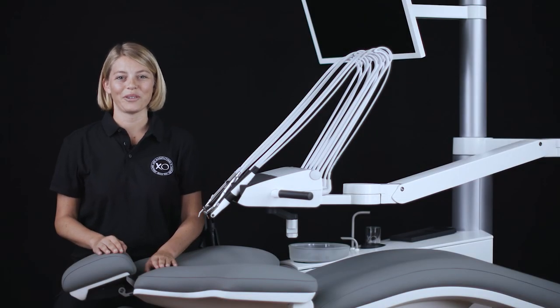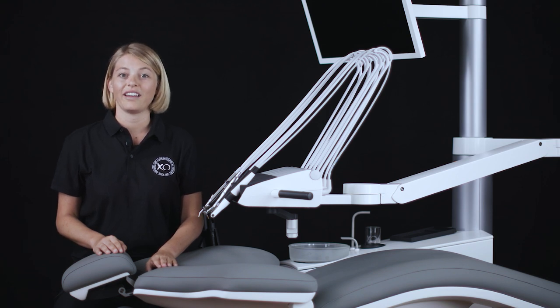In this video tutorial you will learn about the basics of working with different positions of the IXO unit chair and how they affect your workflow. We will also talk about the different working positions that will help you work in an efficient and ergonomic way.